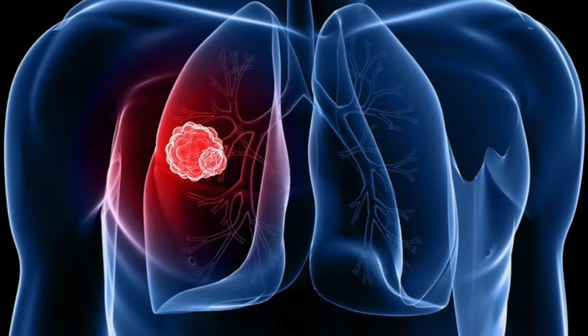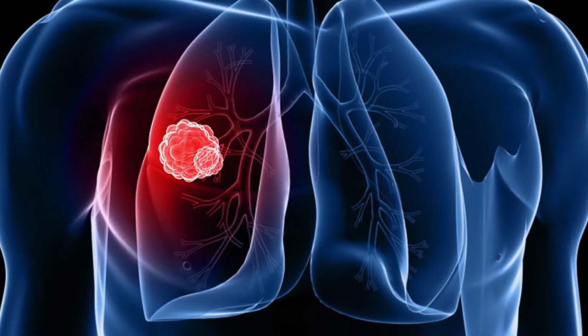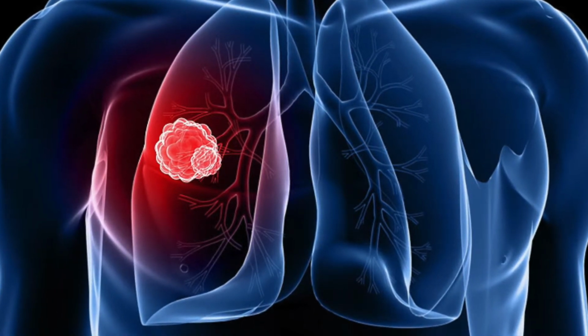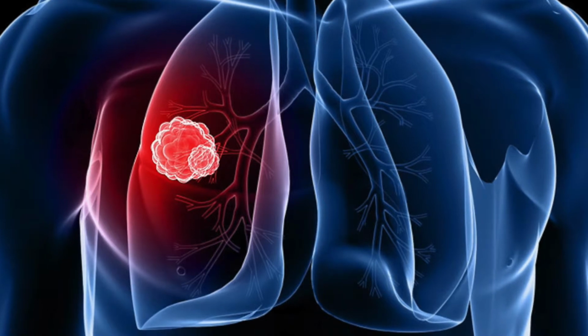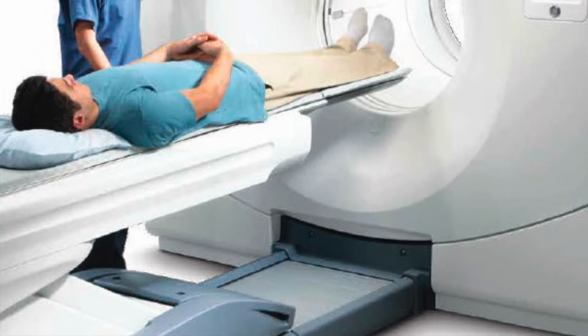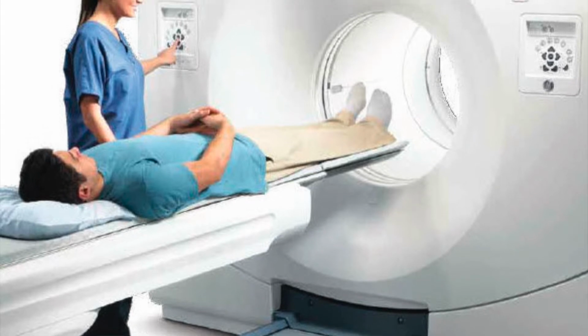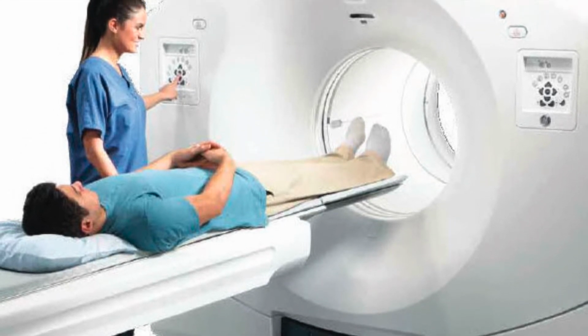Furthermore, it can also help detect cancer, such as lung cancer and breast cancers, or any other diseases that have spread, but lung cancers and breast cancers are the biggest ones. In addition, the scanner can also help doctors gain the most information needed to make a diagnosis and determine the most appropriate treatment.